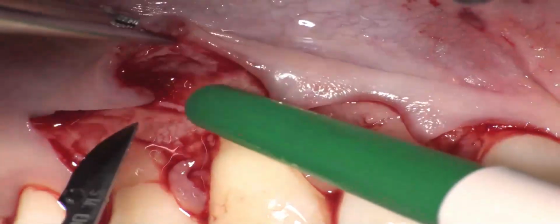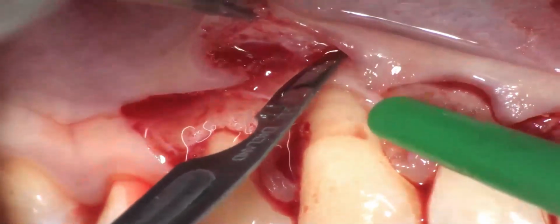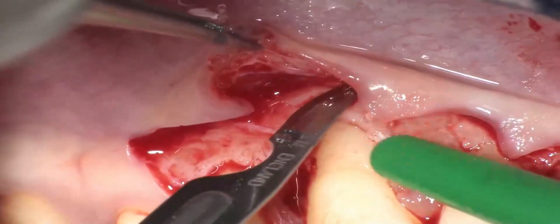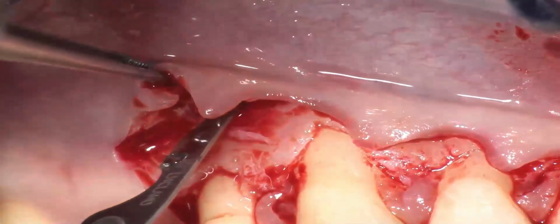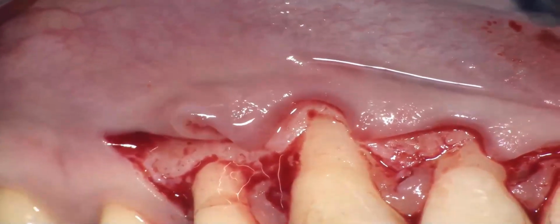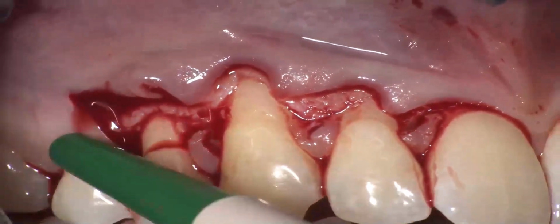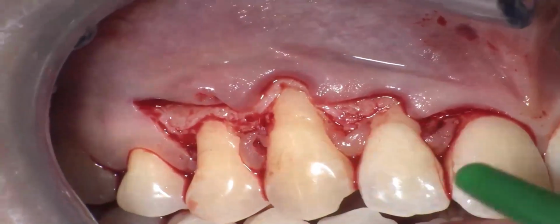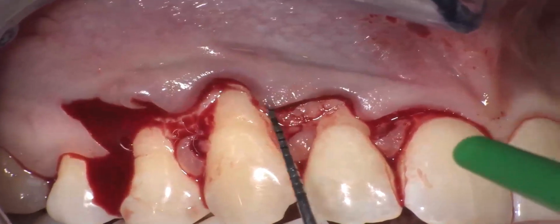Again here, muscle attached to the bone, now parallel to the bone, parallel to the bone, and only the periosteum is left above the bone. And once this deep incision has been performed, sonda, I can use the probe to go parallel to the lining mucosa.